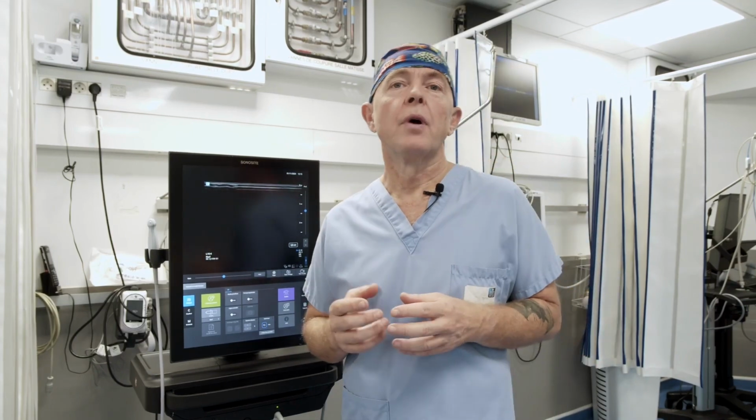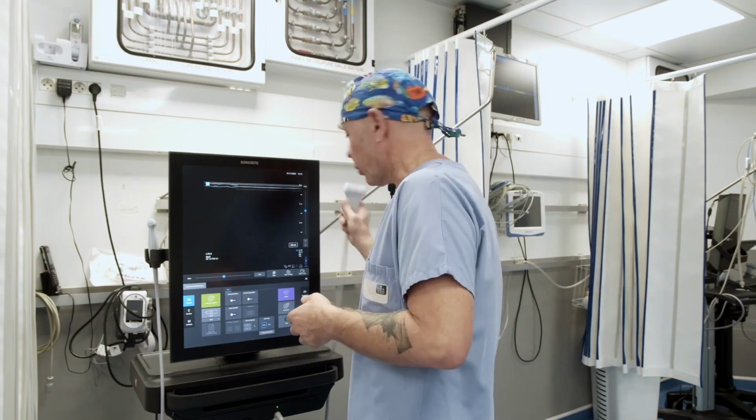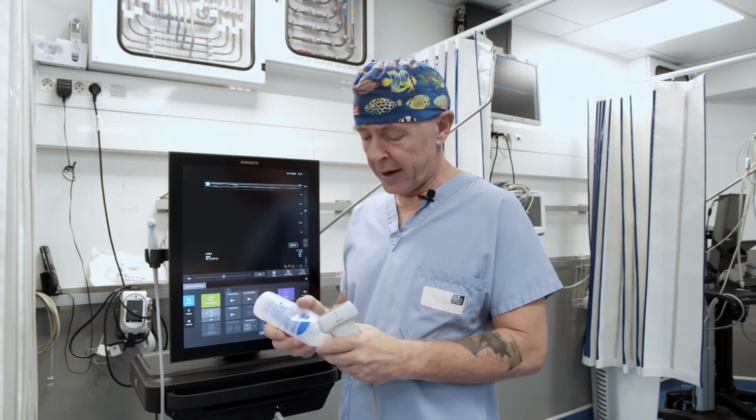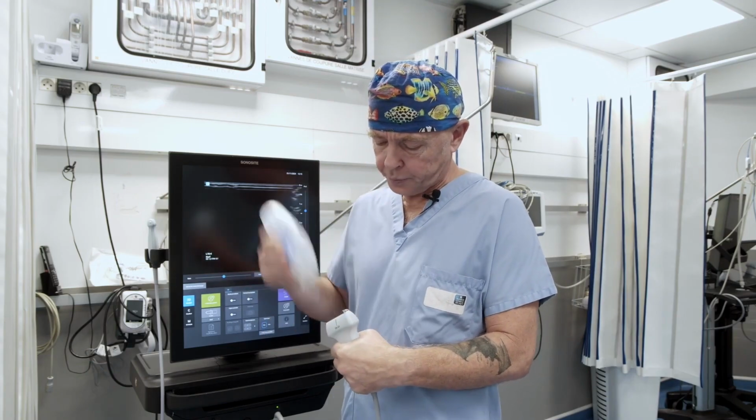The practical workshop number 2, which corresponds to the second step of the Evolubloc method, involves acquiring the skill to recognize a specific area and becoming familiar with positioning its image precisely at the center of the screen. This includes being able to move it and, most importantly, to dynamically follow this structure. Therefore, you take your ultrasound device, which is something you can easily do on your own forearm or on yourself.